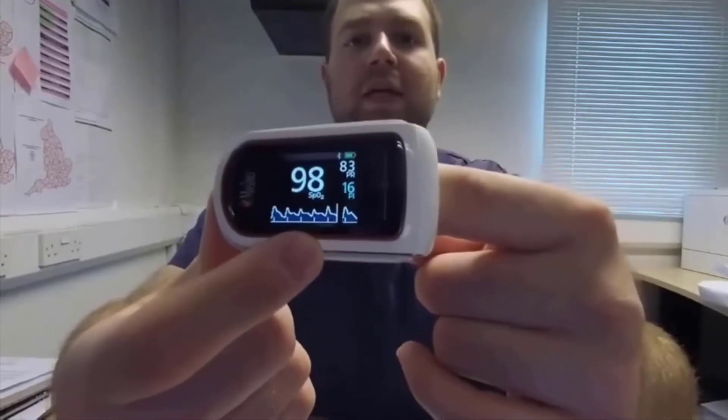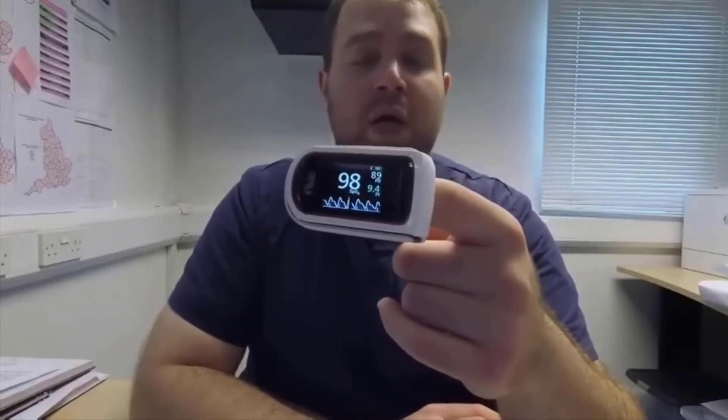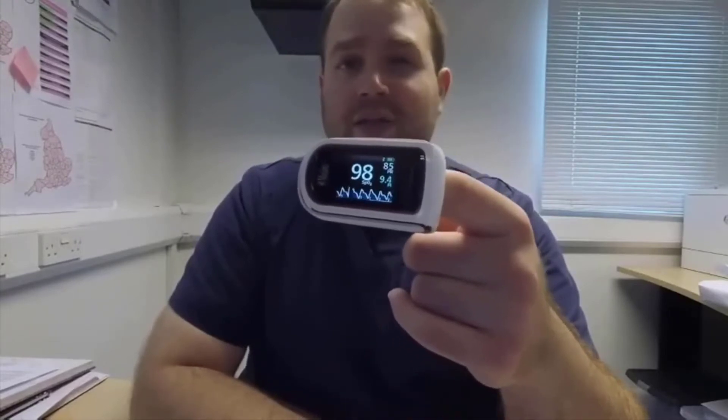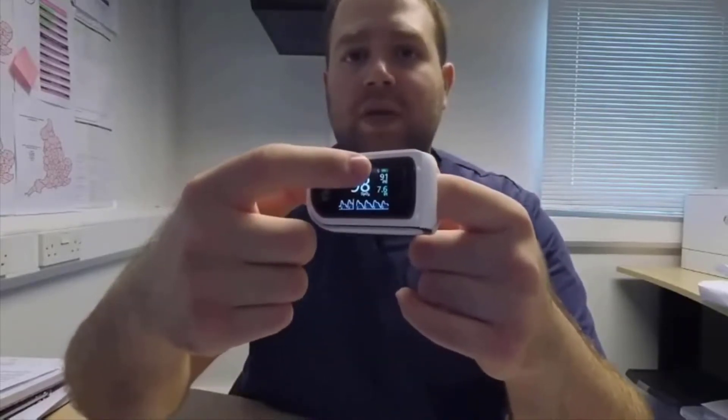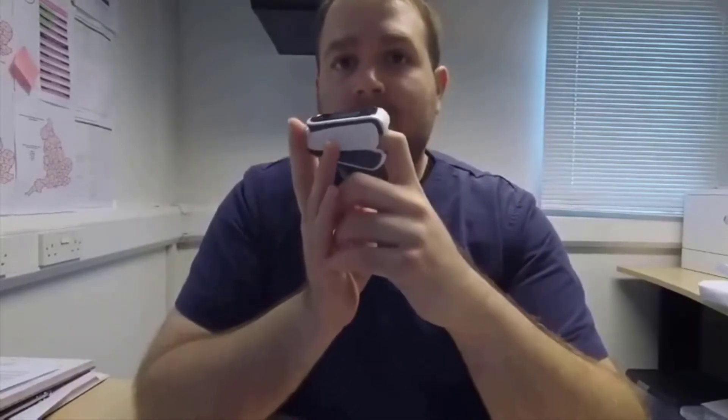On the screen you can see the saturation, pulse rate, perfusion index, and a photoplethysmographic waveform with little vertical lines that represent the Signal IQ. This device has both Signal IQ and SET — which stands for Signal Extraction Technology. This allows the device to get a good measurement even with low perfusion or with motion artifact, which are the two situations where normal pulse oximeters usually struggle. On top you have the battery and Bluetooth indicator.